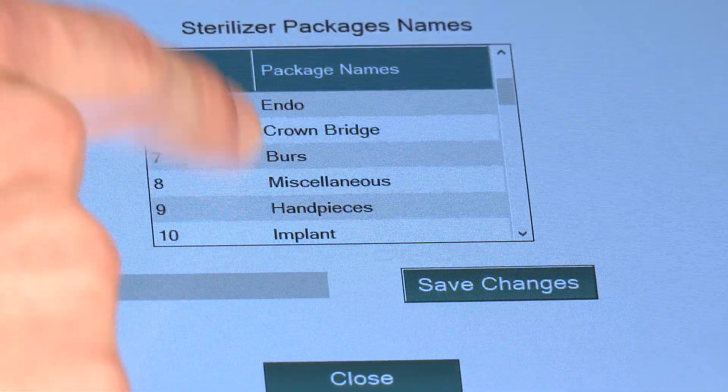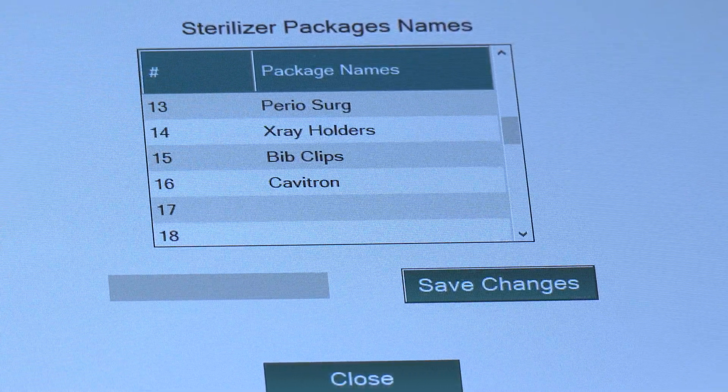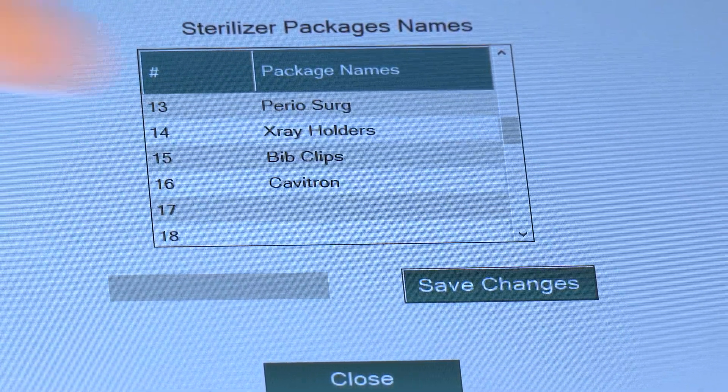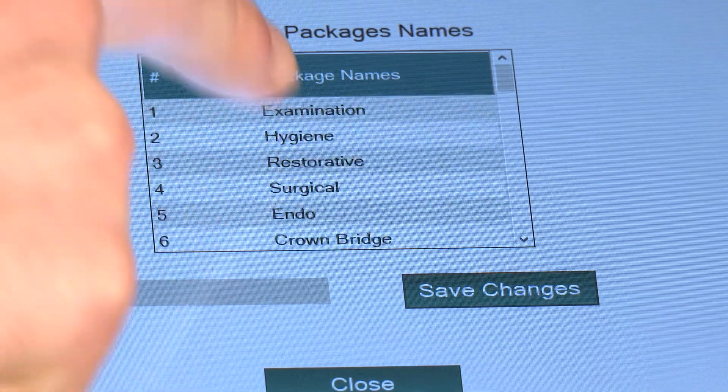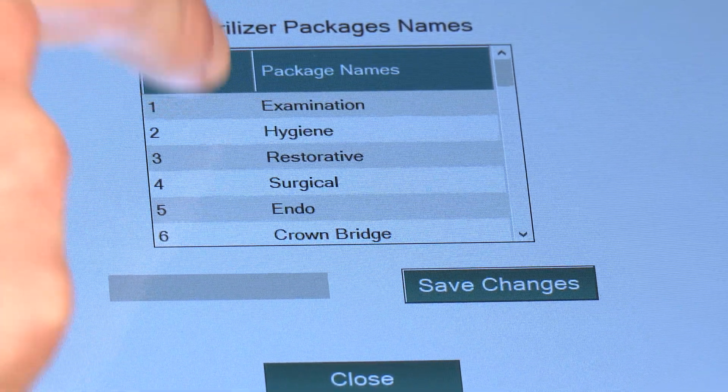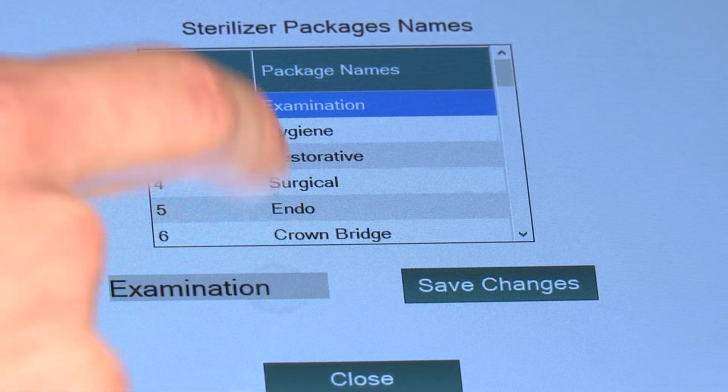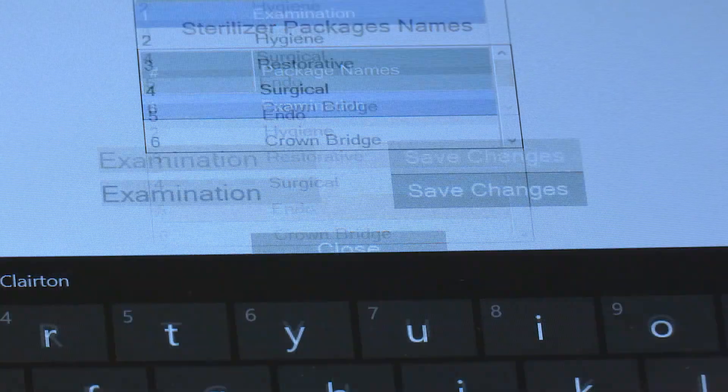You'll notice that Cavitron has been added to the list. To modify a name, select the row and make the changes.